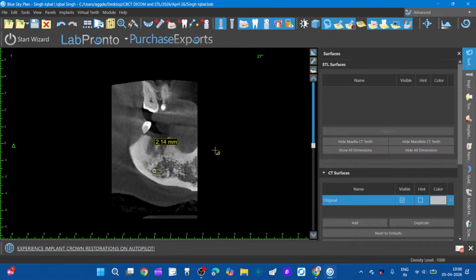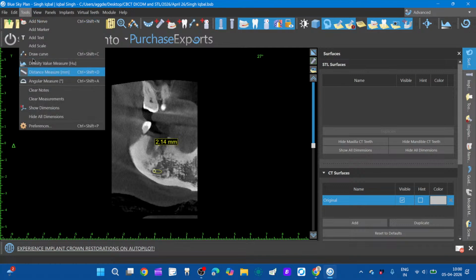Say you can just drill one hole and then you expand. But remember, these areas are not hollow. They have bone which is not mature enough. So it will not be that difficult as you do with the immediate extraction. Yeah, it can slip. So you need to be very careful.